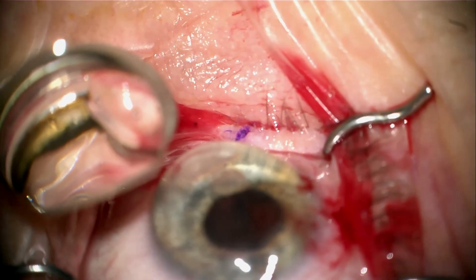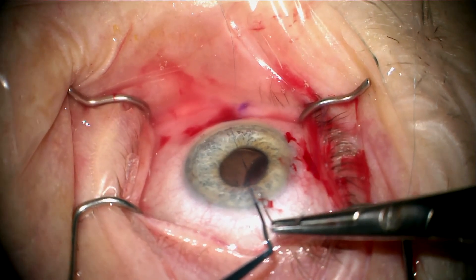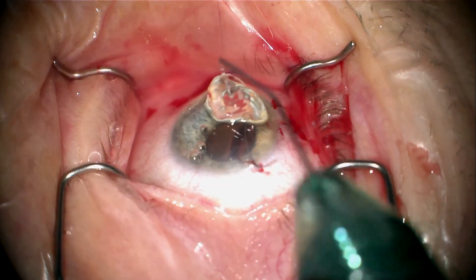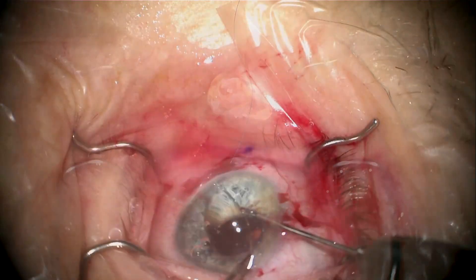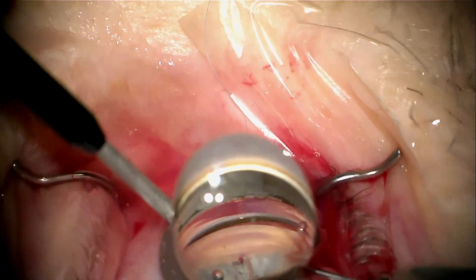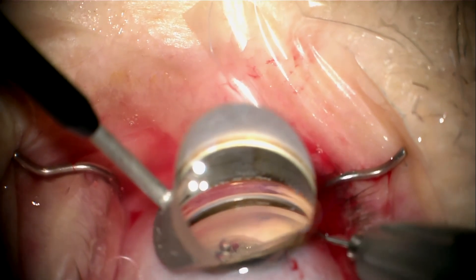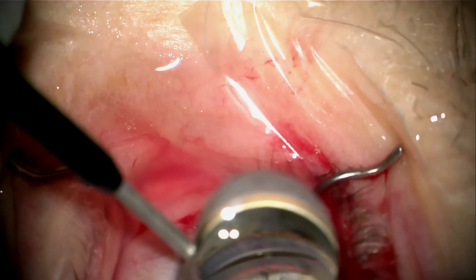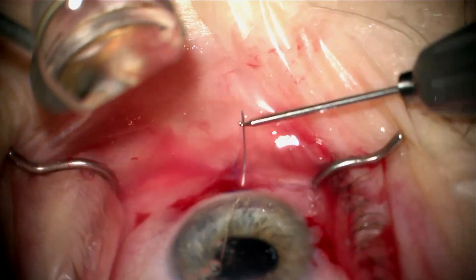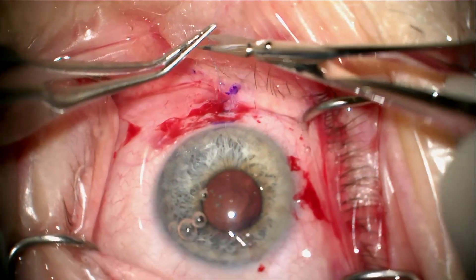It is a tight working area here — she has a bit of a crowded orbit. This is the second half of the suture. Being very careful not to catch any stromal fibers here in the cornea — that would not be good. We want to make sure we're completely in the eye with the needle. Grab the tip of the needle, and under direct visualization with gonioscopy, I'm going to pass this through the root of the iris and the ciliary body, and push this out through sclera to hopefully approximate the ciliary body to the wall of the eye with this mattress suture, placed under direct observation.